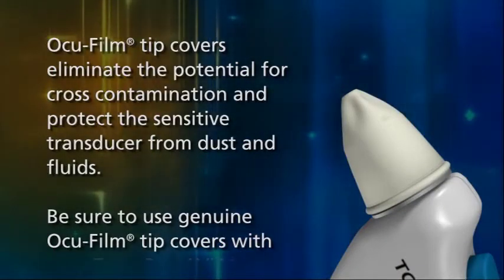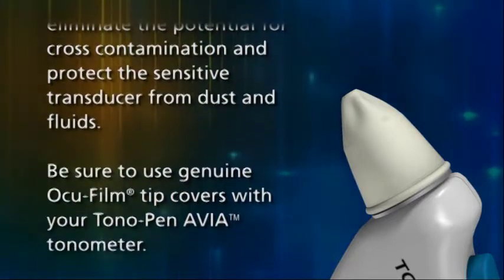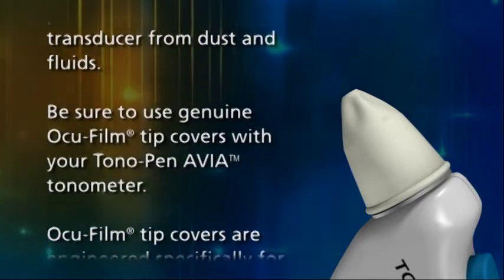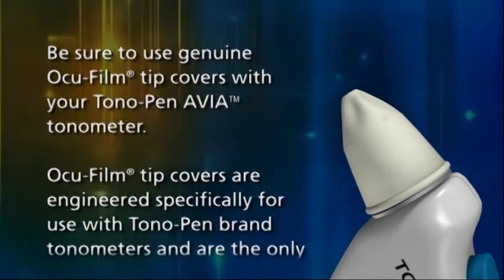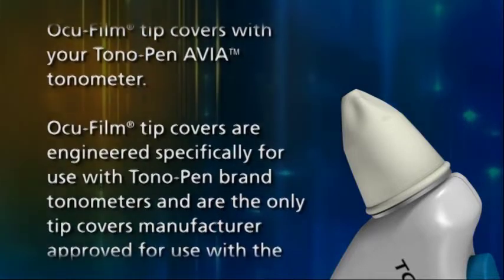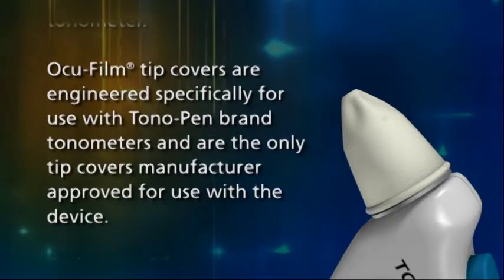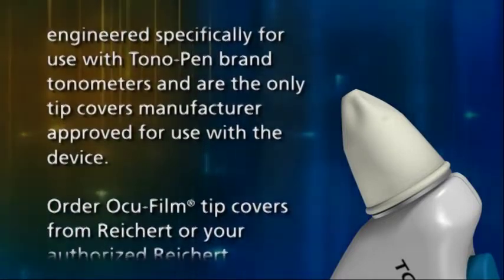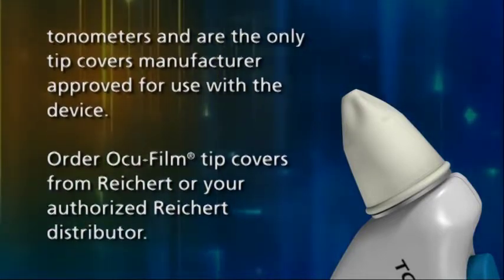Occufilm tip covers eliminate the potential for cross-contamination and protect the sensitive transducer from dust and fluids. Be sure to use genuine Occufilm tip covers with your Tonopena Via Tonometer. Occufilm tip covers are engineered specifically for use with Tonopena brand tonometers and are the only tip covers manufacturer-approved for use with the device. Order Occufilm tip covers from Rikert or your authorized Rikert distributor.